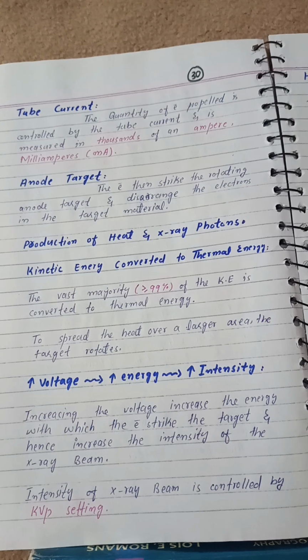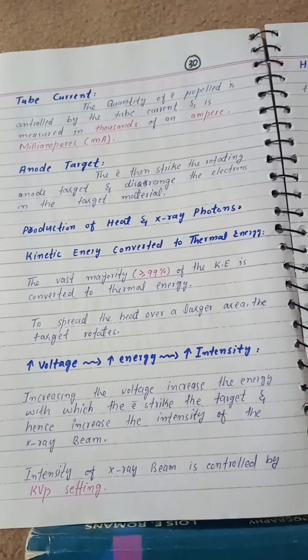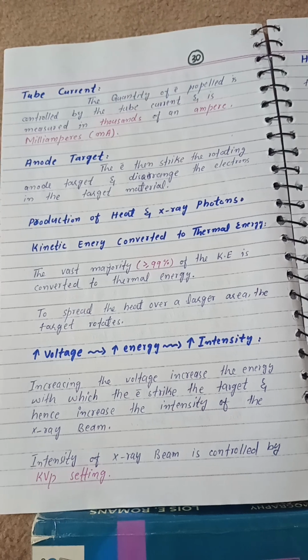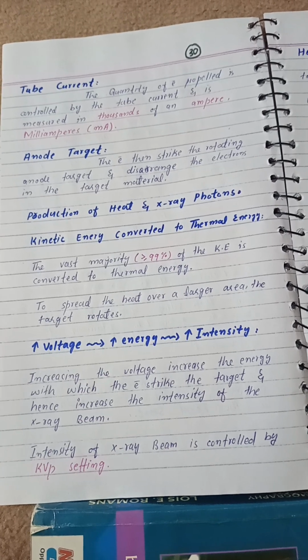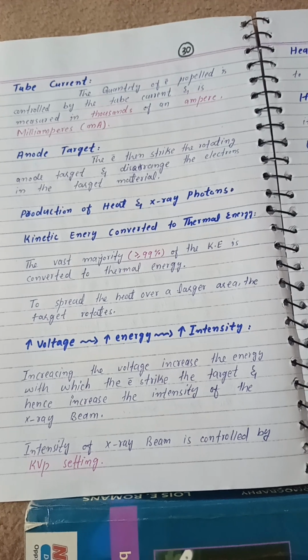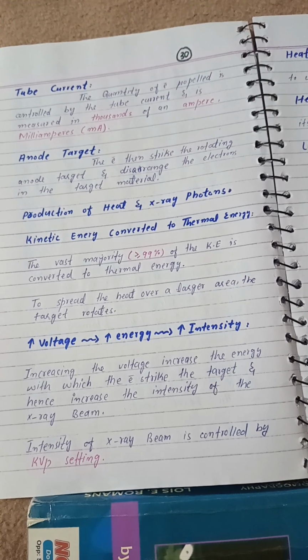The electrons then strike the rotating anode target and disarrange the electrons in the target material. Production of heat and X-ray photons: kinetic energy is converted to thermal energy. The vast majority, greater than 99% of the kinetic energy, is converted to thermal energy. To spread the heat over a larger area, the target rotates.